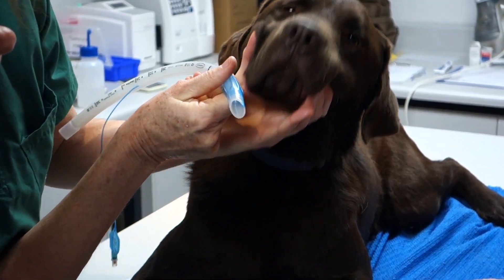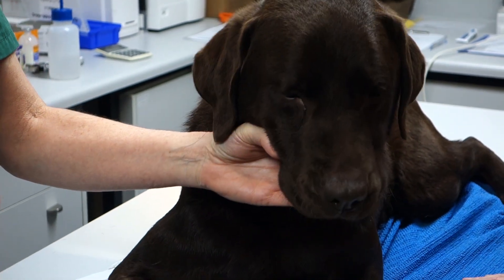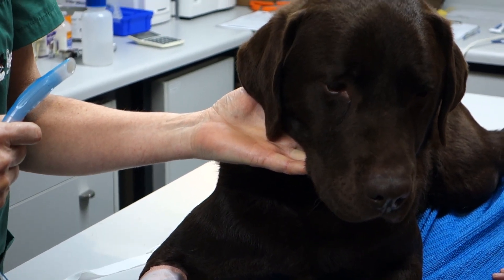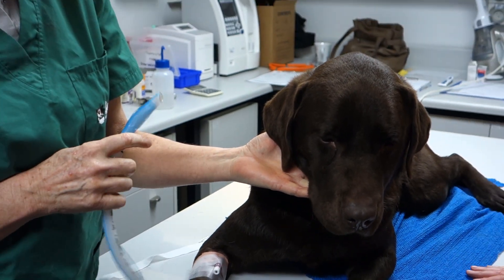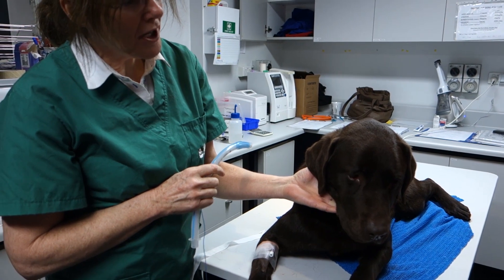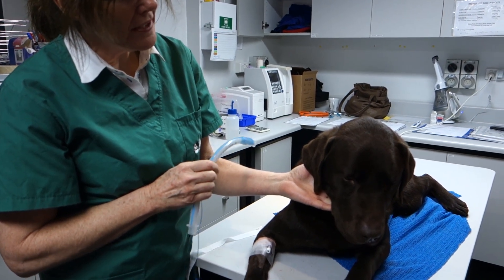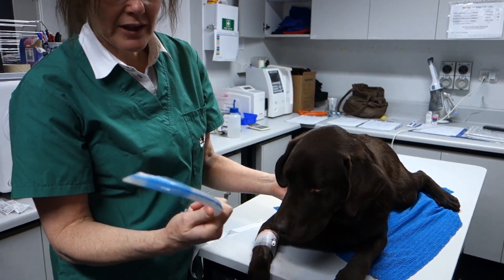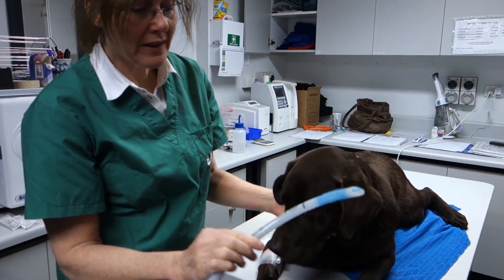You can see that's probably around about the same size. A more mathematical way of doing it is getting their weight, dividing their weight by four, and then adding four. He's 30 kilos — that's roughly divide by four, seven and a half. If we add four, that's somewhere between 11 and 12. And we've selected a size 11 tube.